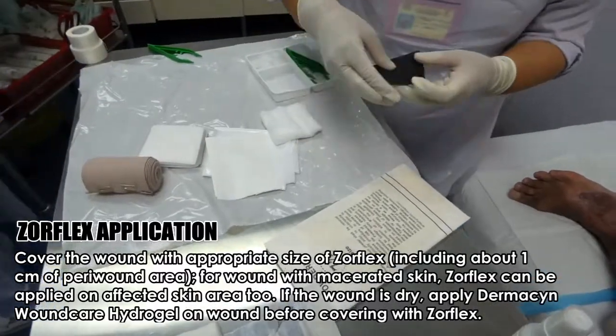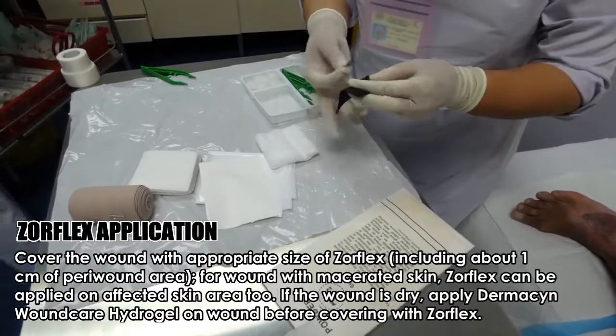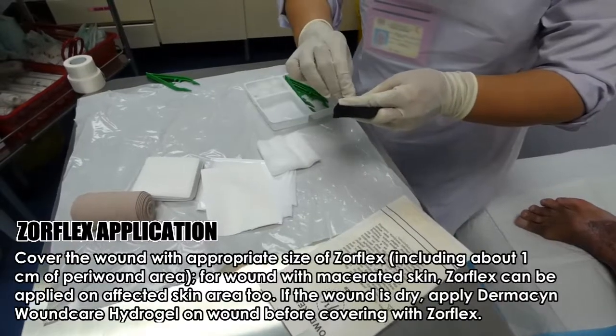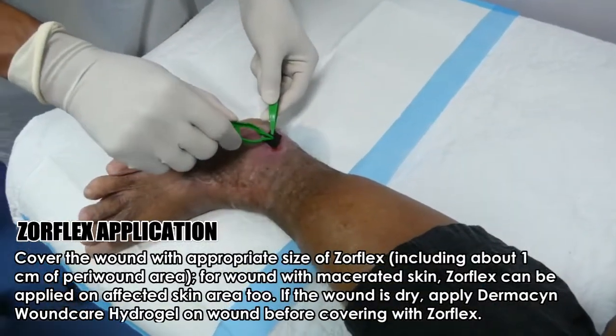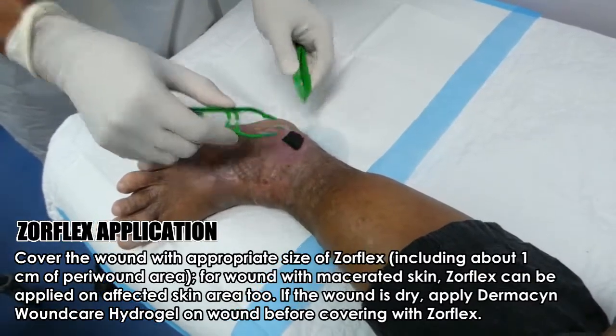Cover the wound with an appropriate size of Zorflex, including about 1 cm of peri-wound area. For wounds with macerated skin, Zorflex can be applied on the affected skin area too. If the wound is dry, apply Dermacyn wound care hydrogel on the wound before covering with Zorflex.